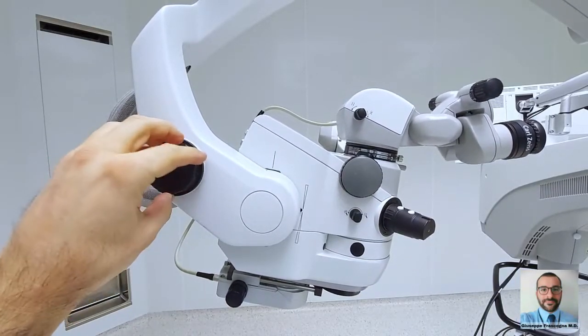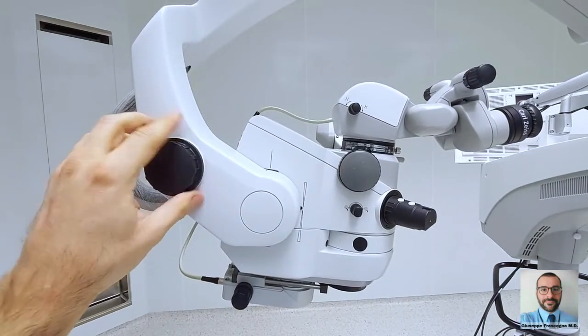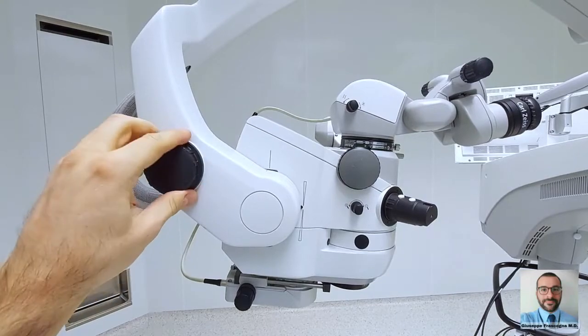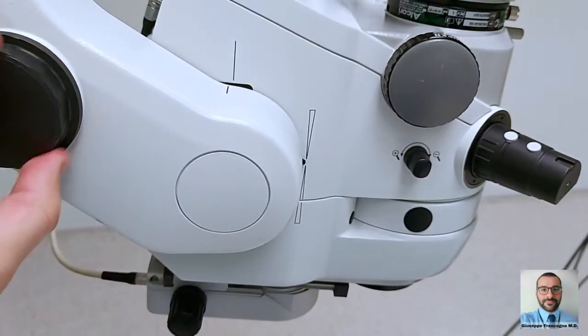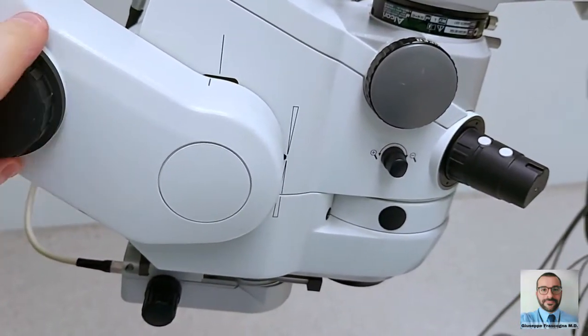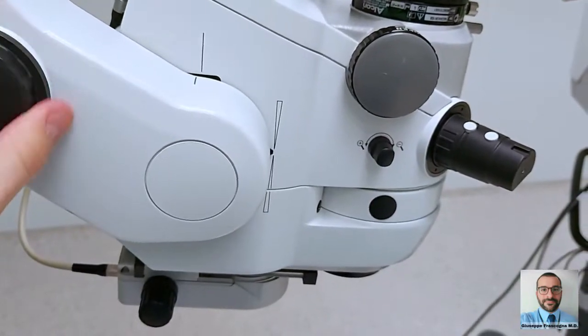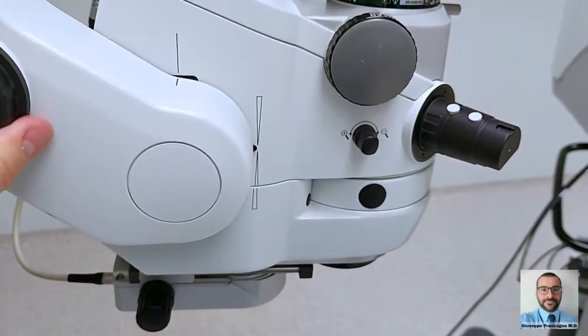The tilting adjustment knob sets the optical axis of the microscope. Usually, a no-tilt setting is recommended — in this way, the optic is perpendicular to the floor. In selected cases, it is possible to tilt the microscope up to 20 degrees posteriorly to reduce the flexion of the elbows. A side indicator shows how far the axis deviates from the perpendicularity.